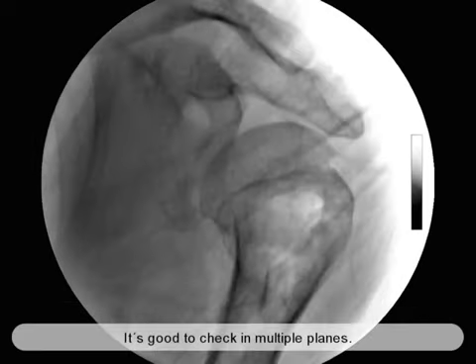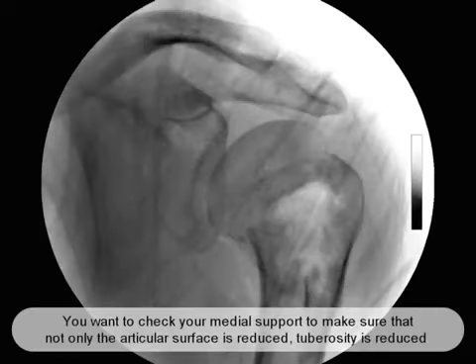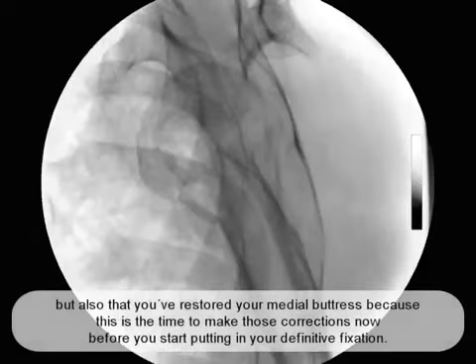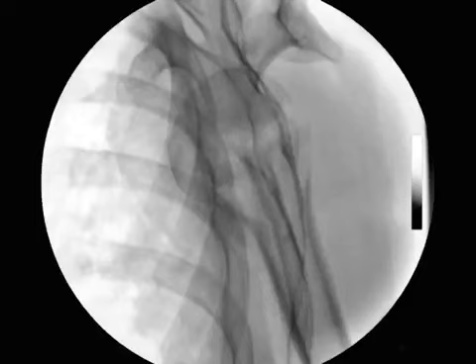It's good to check in multiple planes because sometimes in a single plane it looks good. You want to check your medial, make sure that not only your articular surface is reduced, tuberosity reduced, but also that you've restored your medial buttress, because this is the time to make those corrections now before you start putting in your definitive fixation. We once again see it's been confirmed on the lateral view, and the medial buttress has been restored.